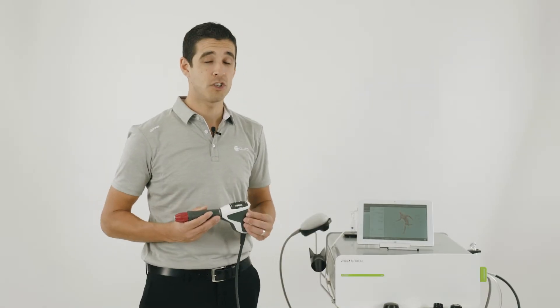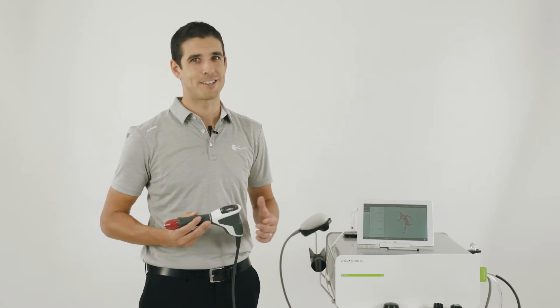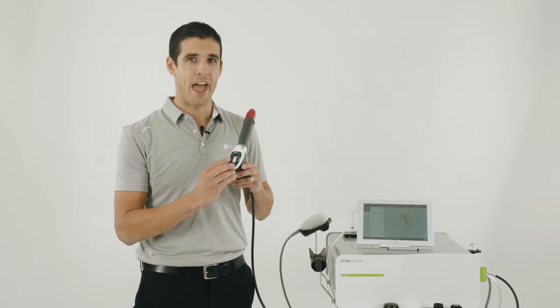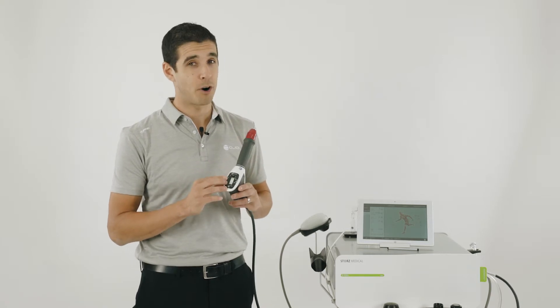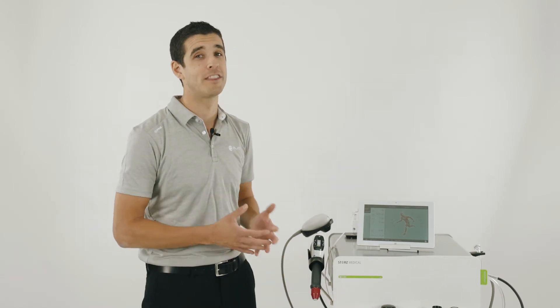The MP200 is also designed to be used without the tablet. If you come into the clinic one day and forgot to charge the tablet, all the features can be controlled on the handpiece. You can also access some programs on the handpiece too. As the MP200 is a premium built machine, you also have the choice to purchase a purpose-built Stortz Medical trolley, which looks really good in the clinic.